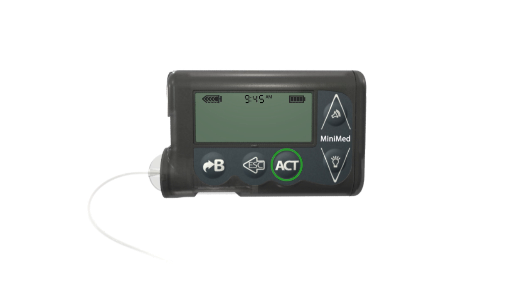You have now completed your sensor insertion and are ready to start the 2 hour initialization period. Be sure you have turned the sensor feature on in your pump.